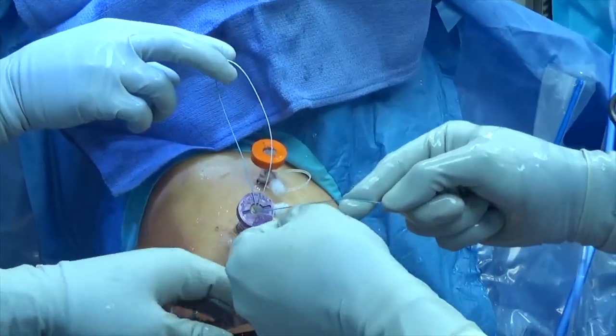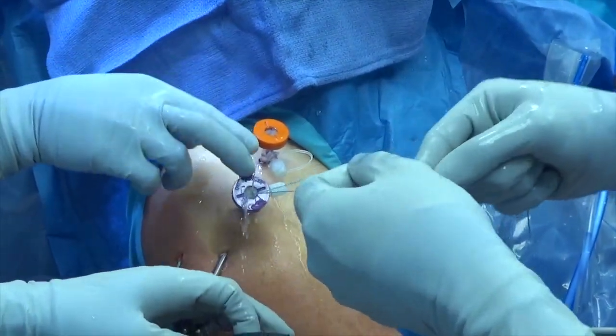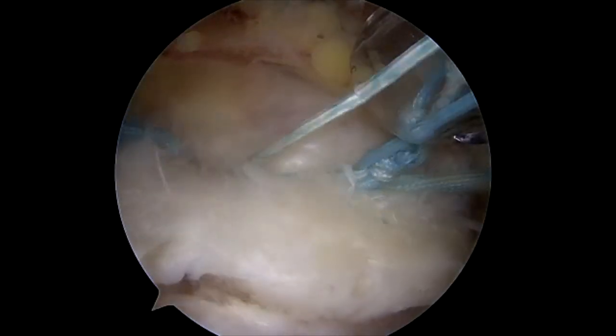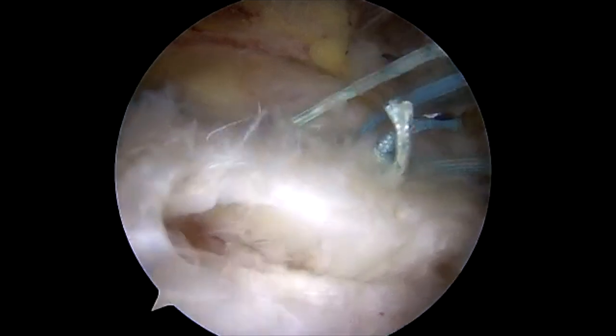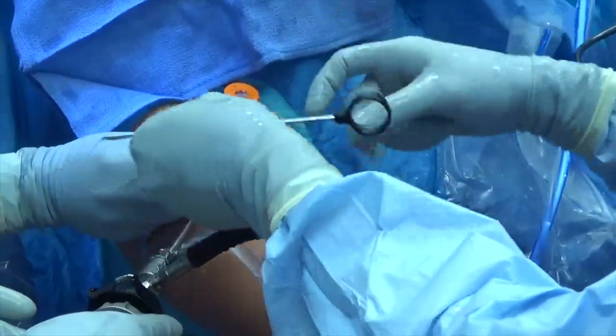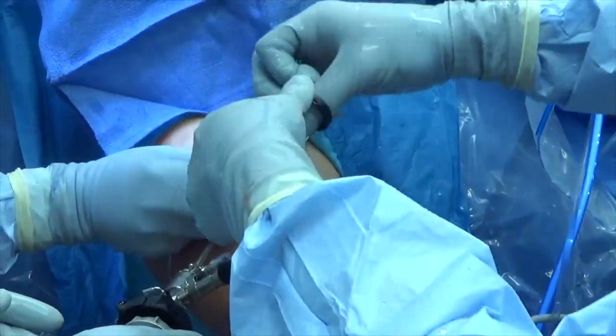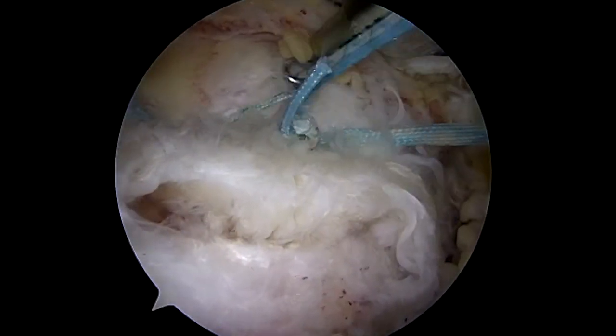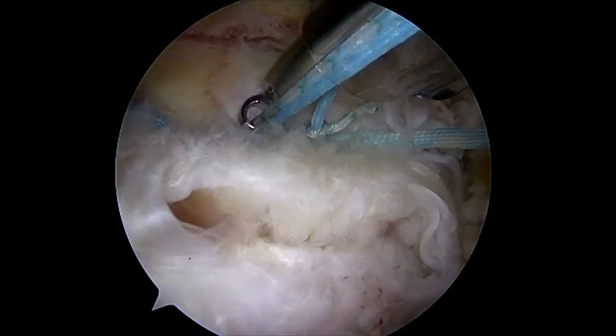Once separated, they are alternately pulled to shuttle the tied suture into the subacromial space. The medial portion of the supraspinatus tendon is nicely re-approximated. An arthroscopic knot pusher is used to deliver several half hitches to tie the corresponding limbs of suture.